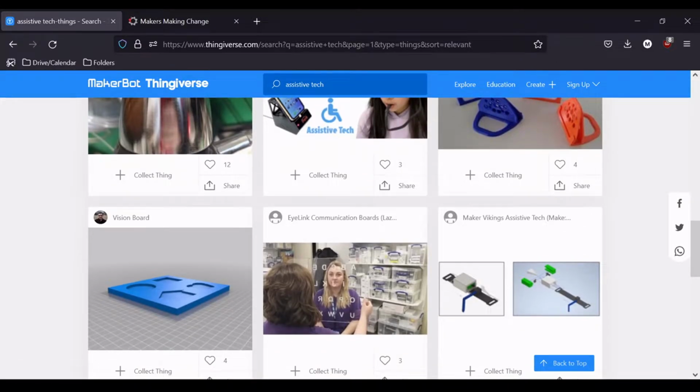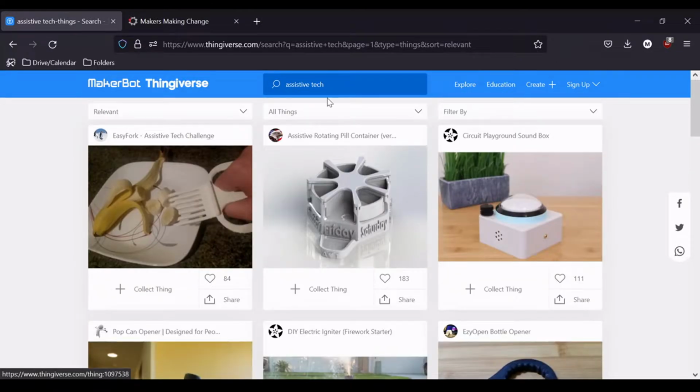The search function isn't particularly great, so don't get discouraged if you don't end up finding what you're looking for on the first try. It might take a couple different tries, but we'll walk through that here in a minute.